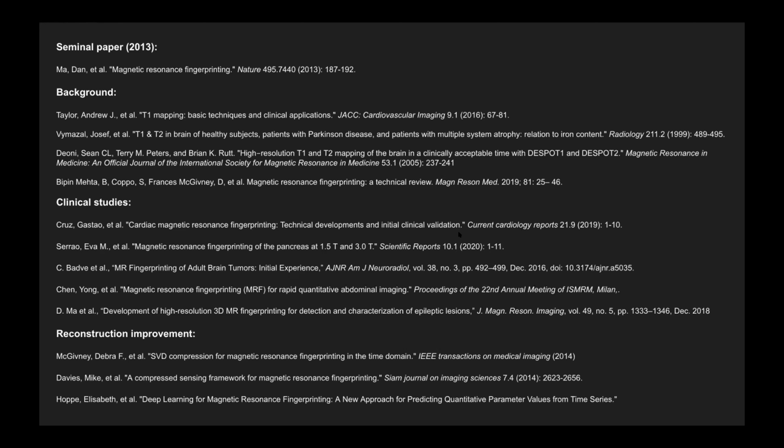But if you don't account for it, then yes, it can skew fingerprints. And the worst possible thing that could happen is it could skew a fingerprint so badly that it matches with the wrong entry, and so you make a misprediction, right? But if you include inhomogeneity as a parameter in your dictionary, then you can actually predict it as well, along with the other parameters.